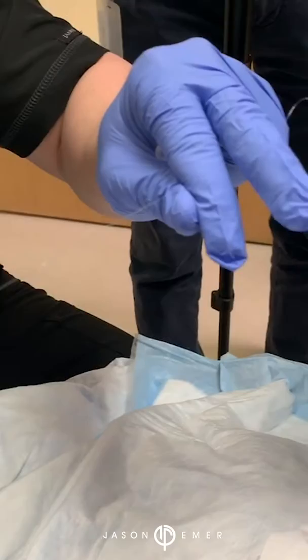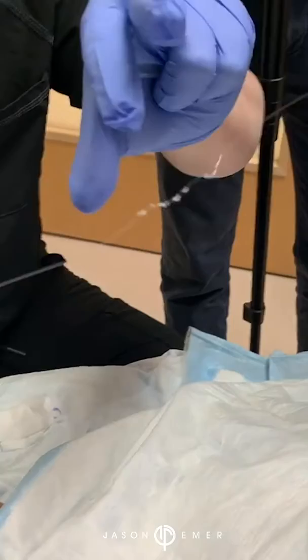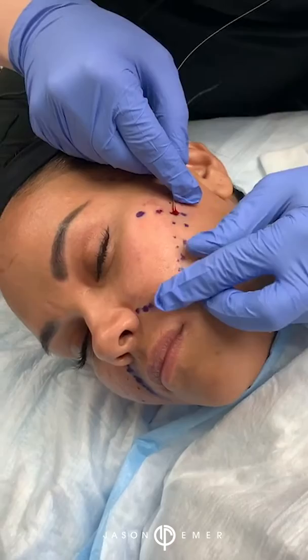We're doing our InstaLift procedure. If you take a look here, this is a suture that has little baby cones on them. It's called bi-directional because on the left side the cones are facing one direction, and on the other side the cones are facing the other direction, with a little space in between. That's the anchor point — that little dot right here. These threads go under the skin and then anchor right in the middle to hold that skin up. I have a very young patient who is just starting to notice a little bit of looseness in her tissue and some increasing nasal labial folds.